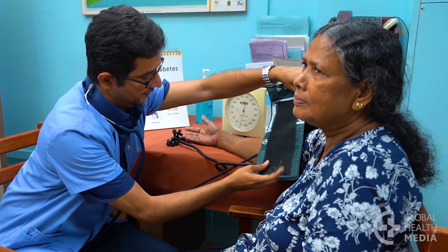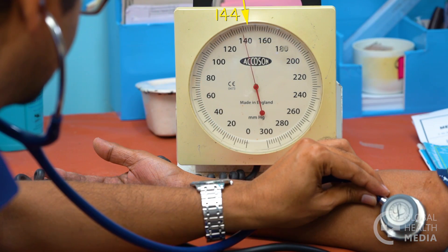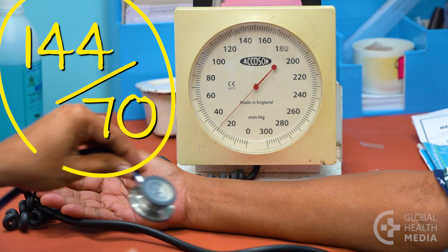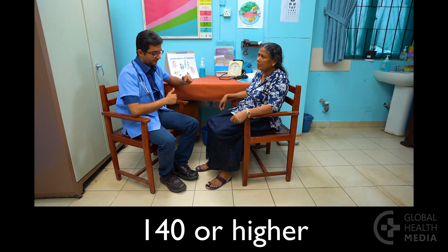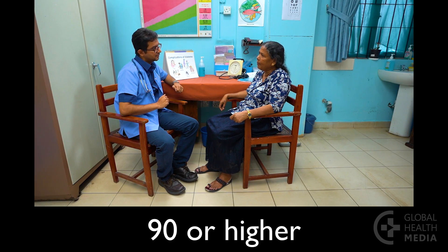If the blood pressure is elevated, take it again after a few minutes. Use the lower of the two readings for the record. Share the results with the person and explain what they mean. A person has high blood pressure if the top number is 140 or higher, or the bottom number is 90 or higher on two different visits.